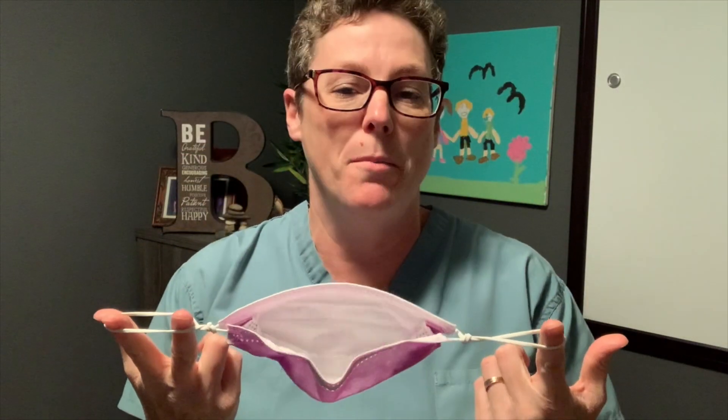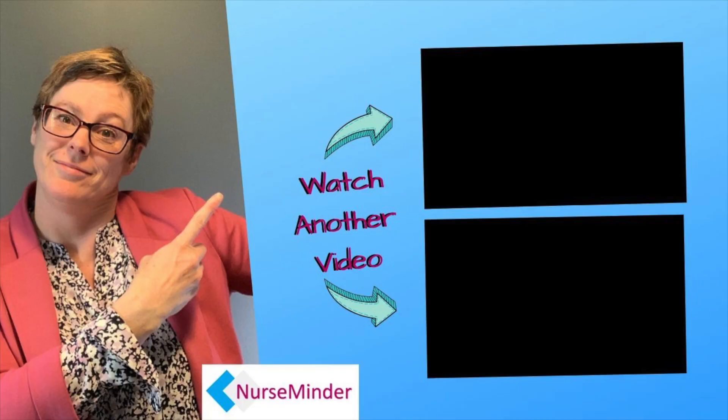Of course, when you take them off, always remove them by the ear loops, discard, and clean your hands. I hope this video finds you feeling a little bit more comfortable in your facility, should you not have enough N95 masks — we can actually create a little bit more of a seal with our surgical mask. Until next time, stay safe and make it a great day.